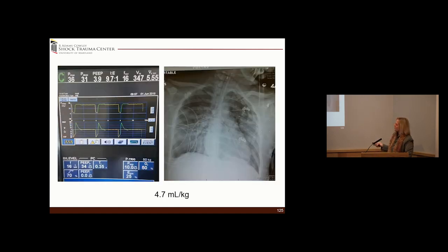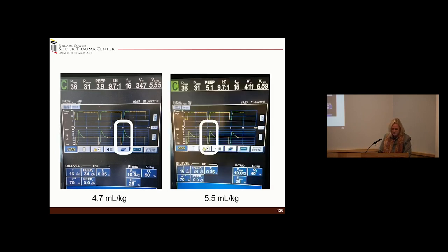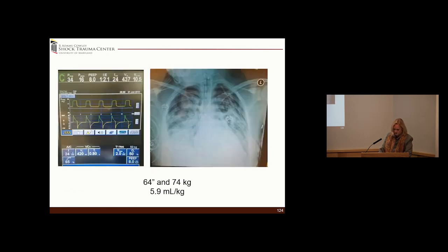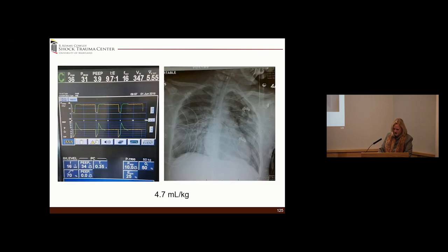So I switch over to TCAV. So that is my T low. So I have 34 over 0. Actually, my rate is only 16, and my T low is 0.35. And was it 16 before? Yes, it was 16. Sorry. I actually came down on the rate, and my tidal volumes are down to 4.7 mLs per kg. Okay, and I've been able to lower my rate.